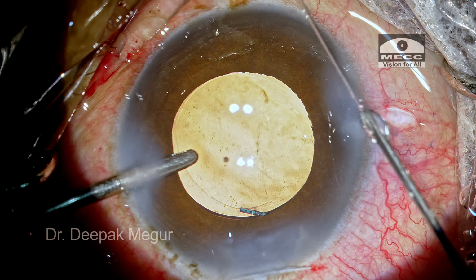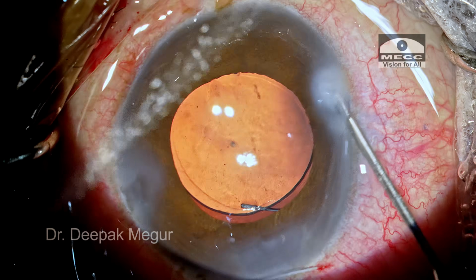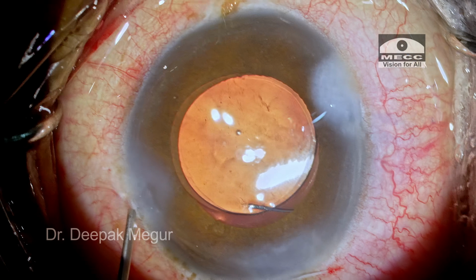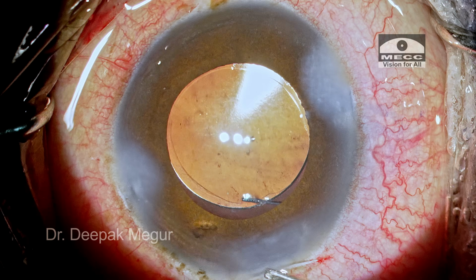Time to close. With the left hand still irrigating, I'm just going to hydrate the side port incisions. The irrigation comes out, the other ports are hydrated, and that's it, the case is done. So this is a short video about how to do a vitrectomy when we have a transzonular vitreous prolapse.